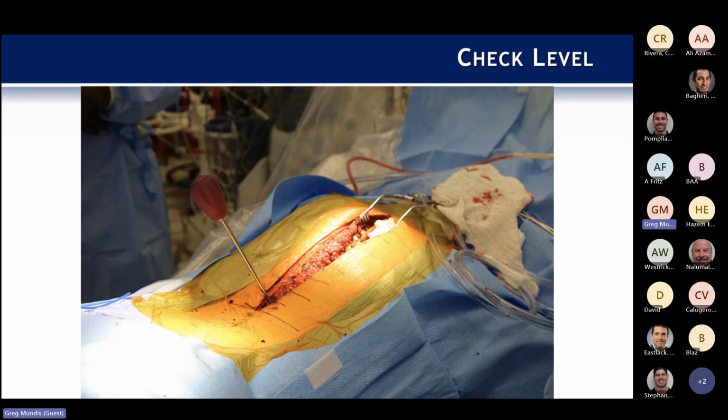Other things in scoliosis, make sure you count ribs and make sure you count lumbar vertebrae, and then don't be afraid to check both APs and laterals if you're uncertain. Those are really important things. So you always like to say, okay, where's the last rib, for instance, and then I'll try to cross-reference that with where the LIV is on the fluoro, and use that as my guide.